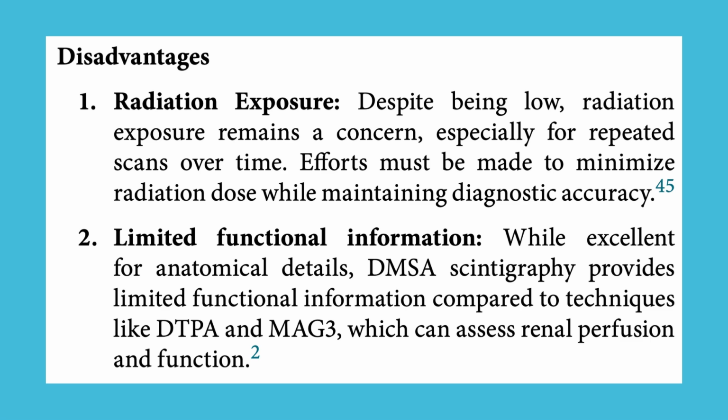2. Limited functional information. While excellent for anatomical details, DMSA scintigraphy provides limited functional information compared to techniques like DTPA and MAG3, which can assess renal perfusion and function.